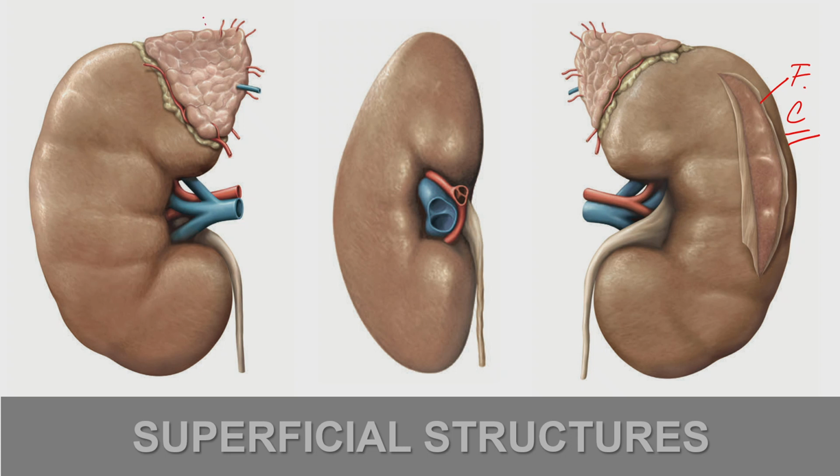On the upper pole, medially, is the adrenal gland, which is separated by a very thin splitting of fibrous and lipid tissue. Those structures we can then observe. This is the sinus. The sinus is a hollow space where we have a vein, artery, and their branches, and the collecting system. The collecting system is dorsal, the most dorsal.